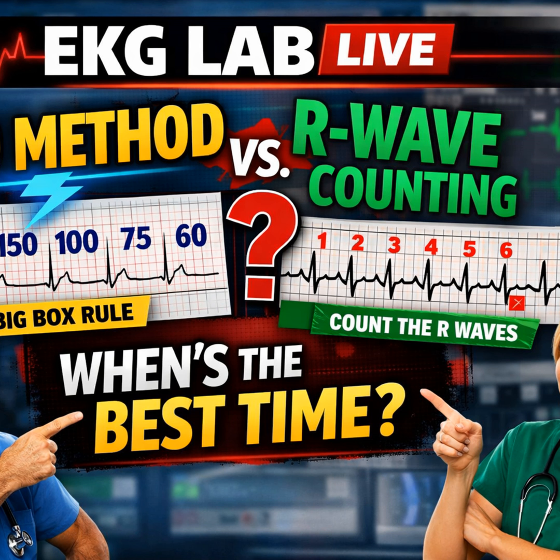A third of the diagnosis missed just because of a story? Exactly. The clinical story corrupted the visual analysis. And this is why I fight for the big box method. It is an objective, mathematical check. How so? Okay, let's say I have a patient who looks fine. My bias says, he's fine, it's just anxiety. If I use the strip method, I glance at the strip, it looks a bit fast, I count roughly, get 110, and I say, sinus tach, anxiety. My bias wins. You confirm what you wanted to see.